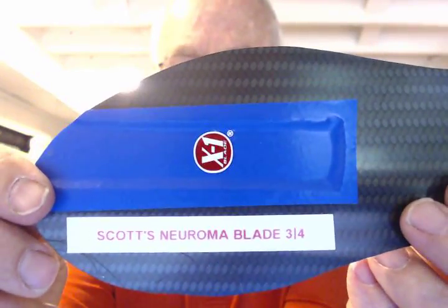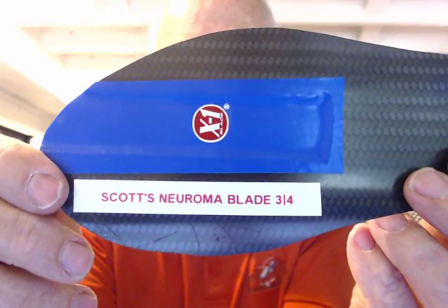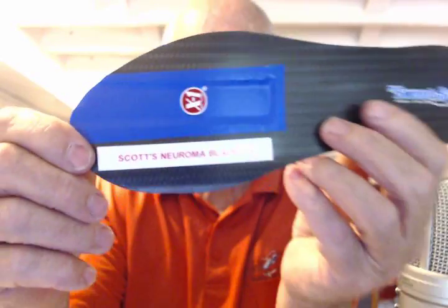It's Clyde with indianabrace.com. I've got Scott's Neuroma pad for the third and fourth web space going out today.